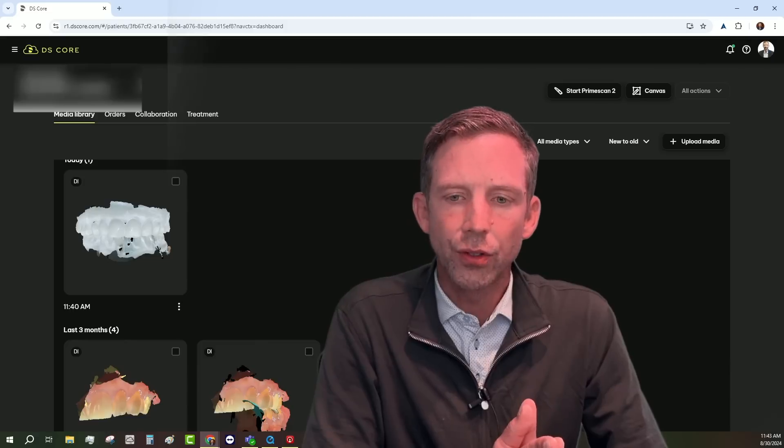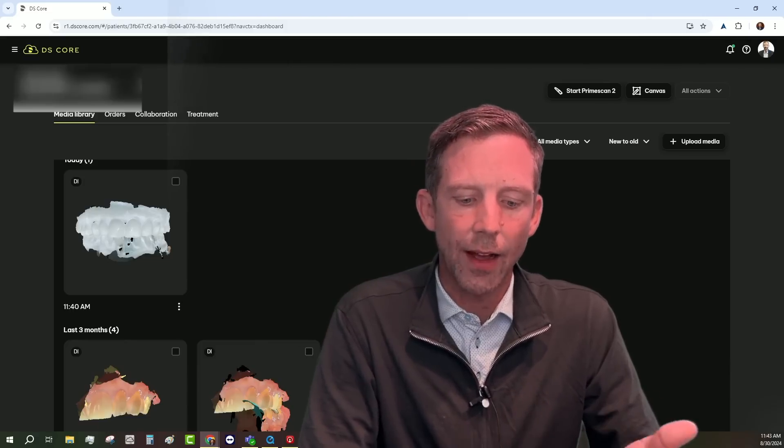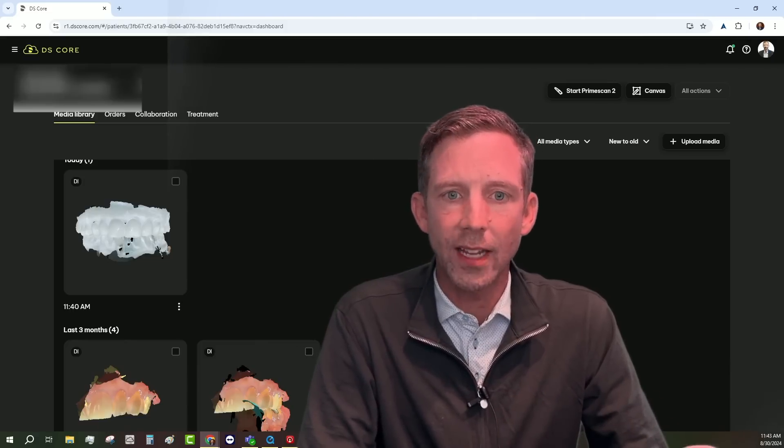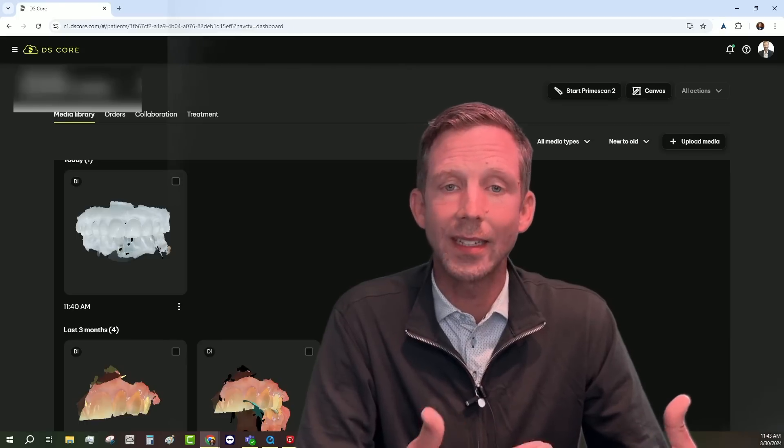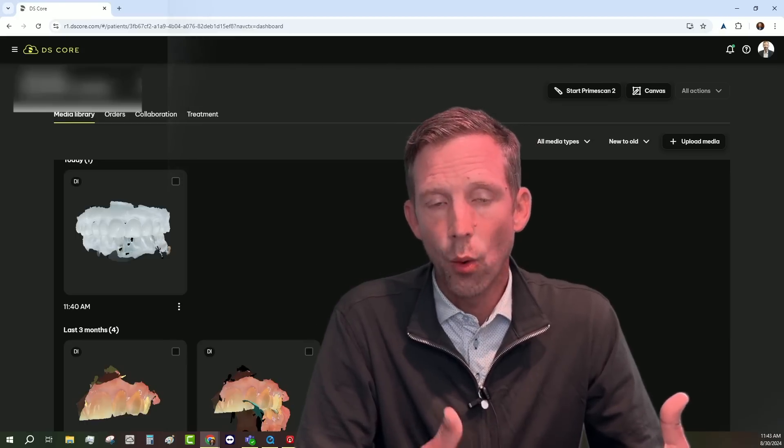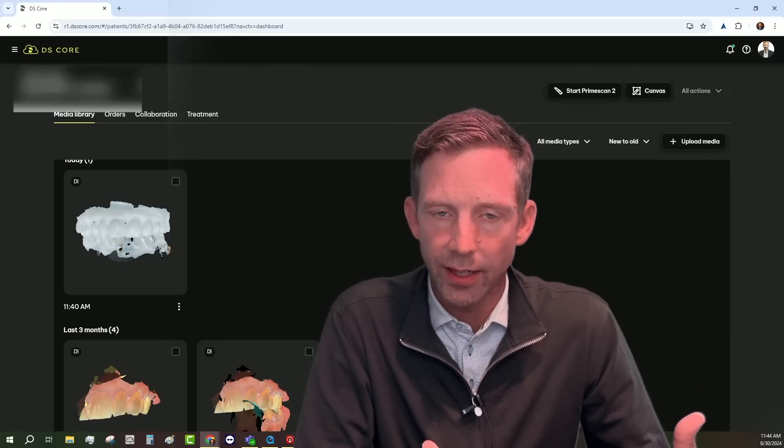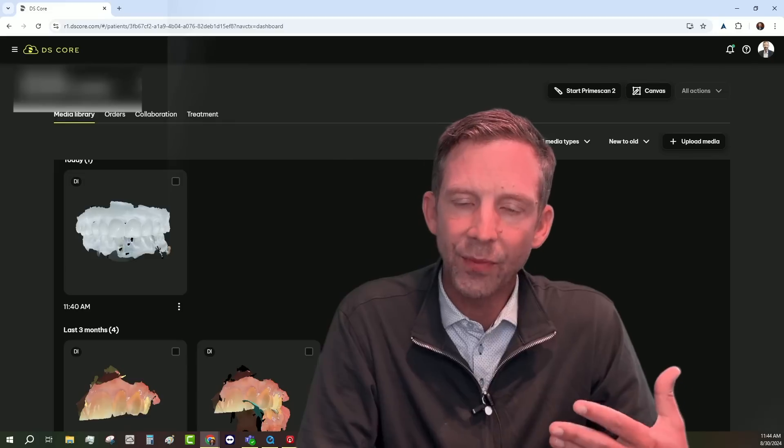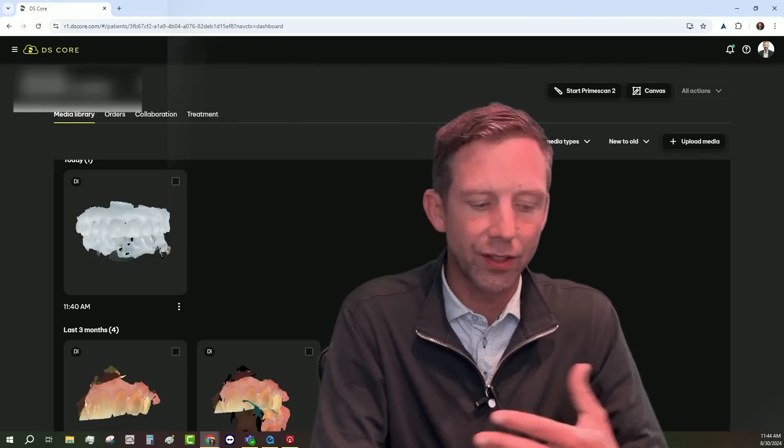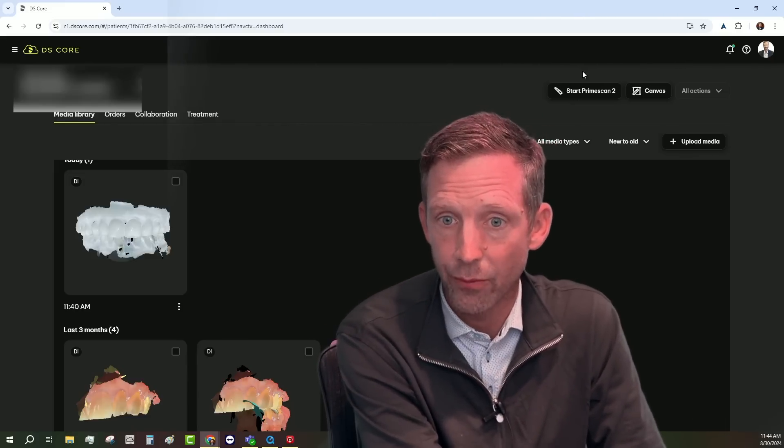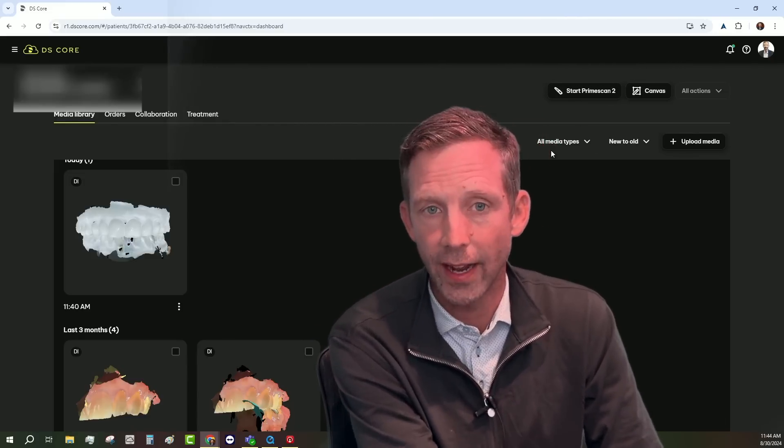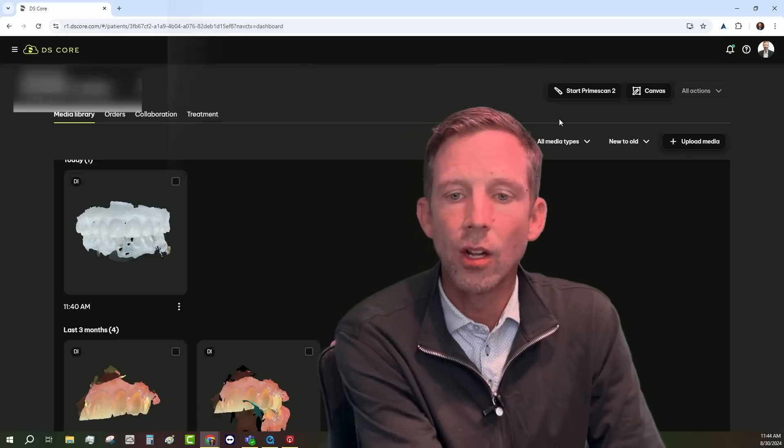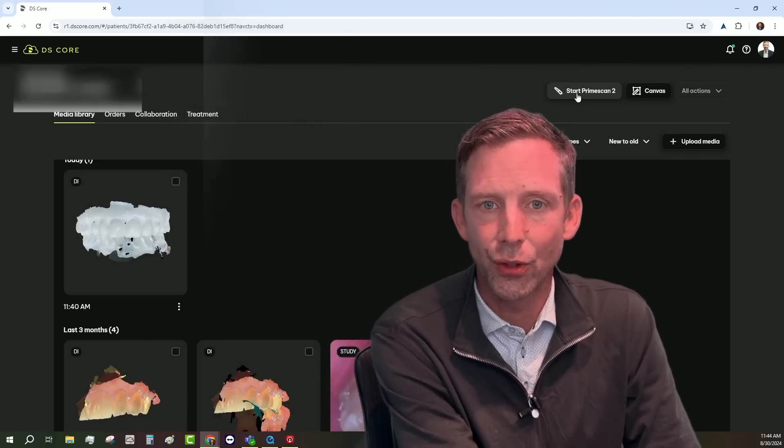So the first thing that we're gonna do is, obviously, PrimeScan 2 is going to be activated within DS Core as a device. Once it's activated as a device in your DS Core, now you'll notice that I have a Start PrimeScan 2 button right up here on the upper right-hand side. So let's go ahead and click PrimeScan 2.